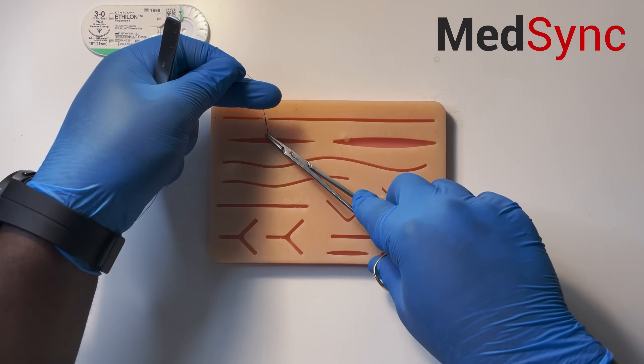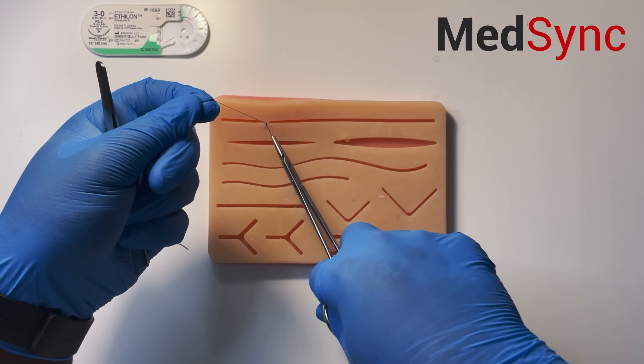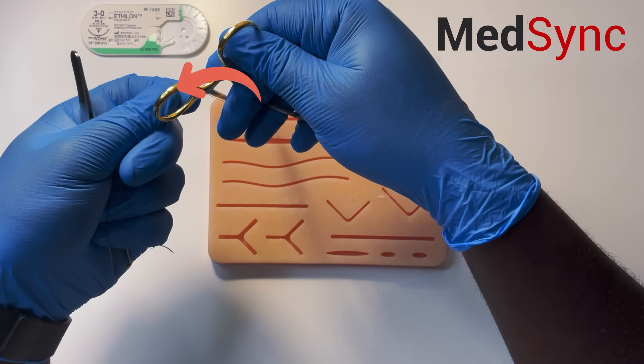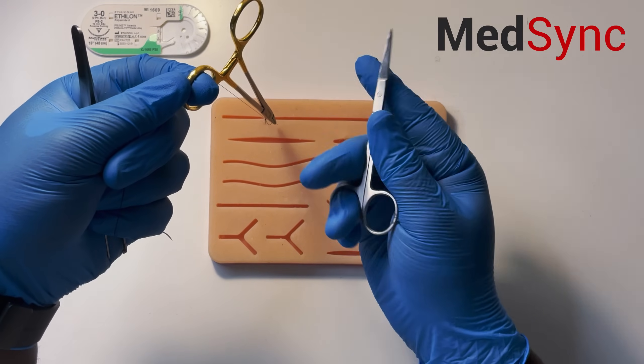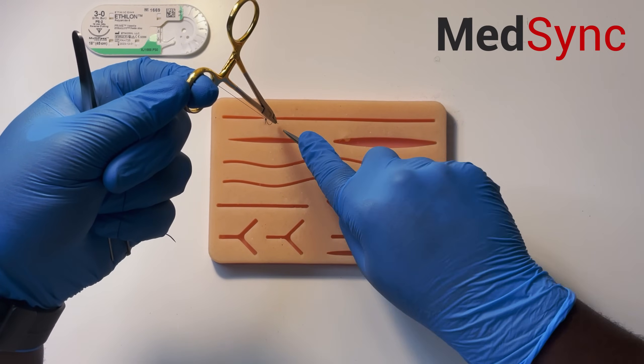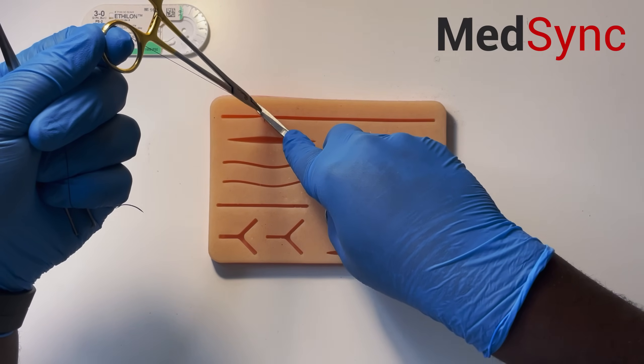Here's the magic. Put everything into your left hand - long suture in my left, needle holder in my left. Put your finger into the ring. Watch this: put your thumb in, open the scissor, slide down and cut.